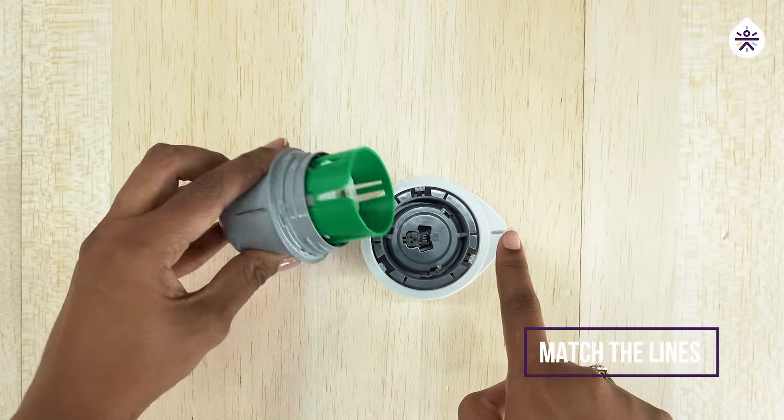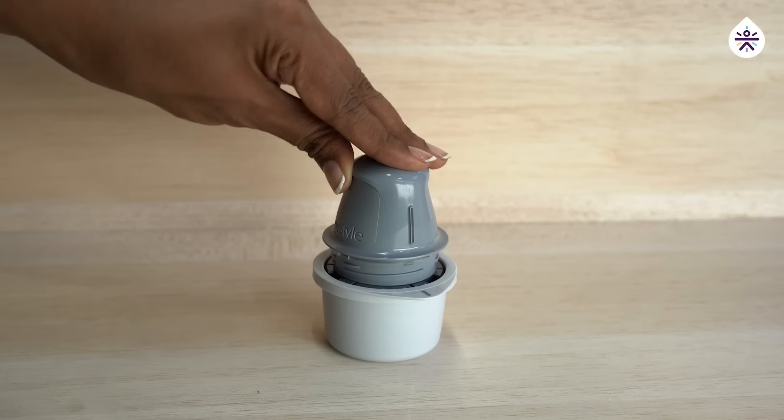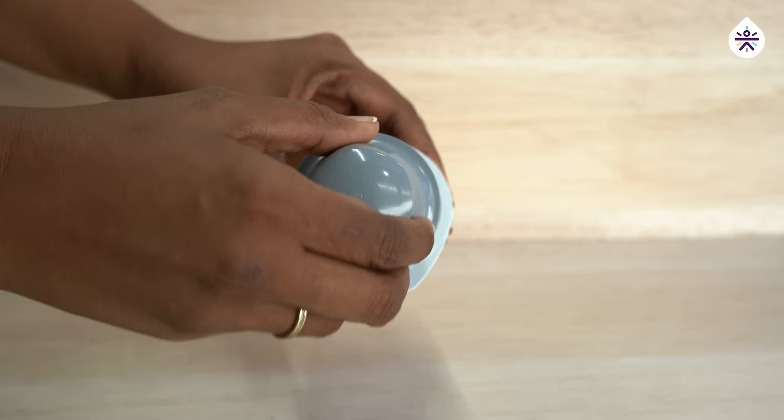Now take the sensor and fix them by matching the gray line. Press down till you hear a click sound. Now your sensor is loaded.